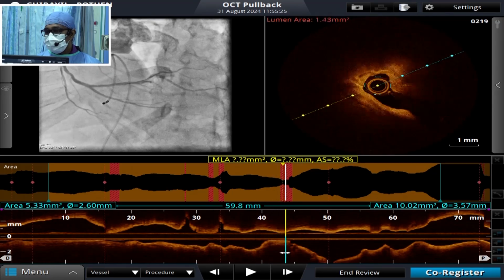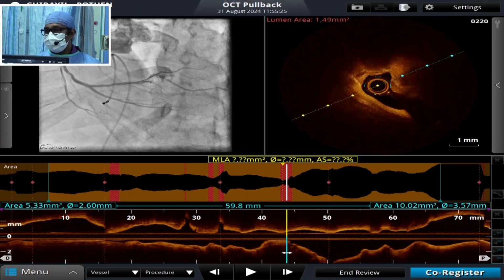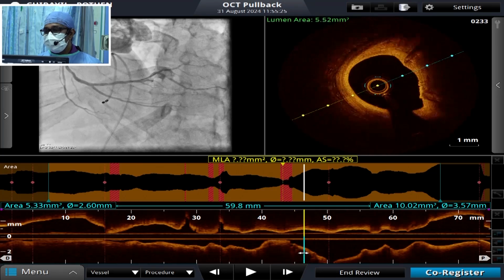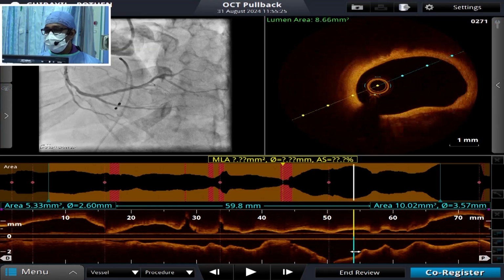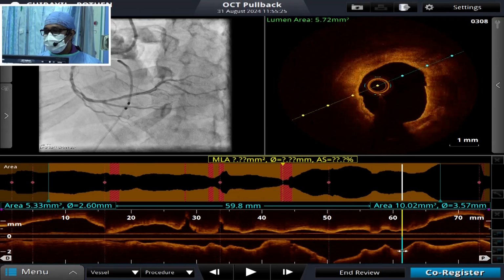At the tightest area, you see a nodule. You do not see any eruptive nodule; it's more of a nodular protrusion close to the imaging catheter. We hope that in this particular case the orbital should shave off some amount of calcification. As we come more proximally, here again there is calcium.